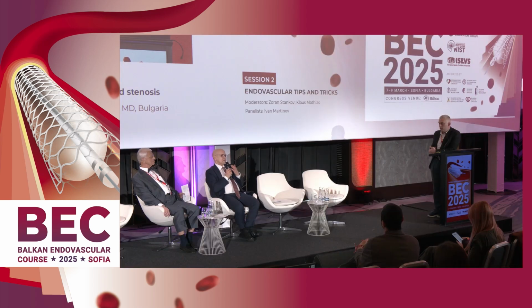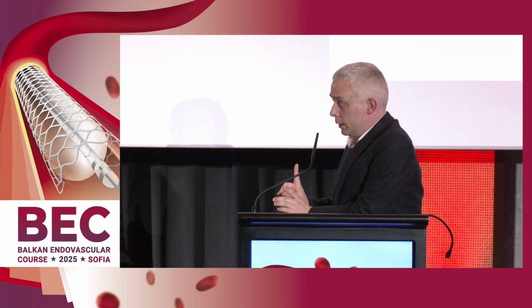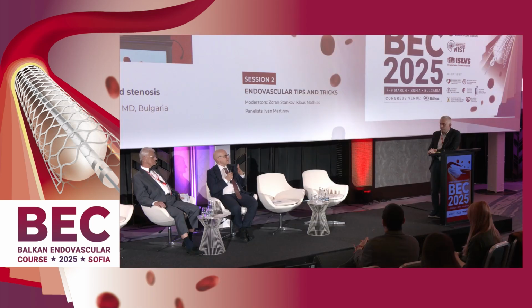Thanks. And the second, it's a comment probably, because this is not near occlusion. These are really chronic occlusions, because the wires that you use in about 7 to 10% of cases are Gaia, Confianza, Conquest, which are chronic wires for chronic total occlusions. Excuse me, only 10% was with Gaia escalation. Yes. I mean, probably the histological finding in this patient is total occlusion. You have to use such wires. They have a tip stiffness between 9 and 12 grams.